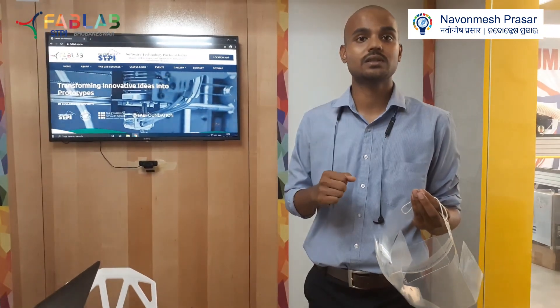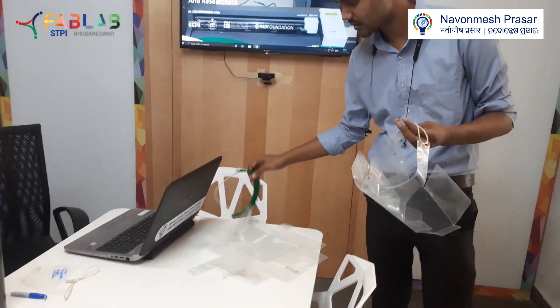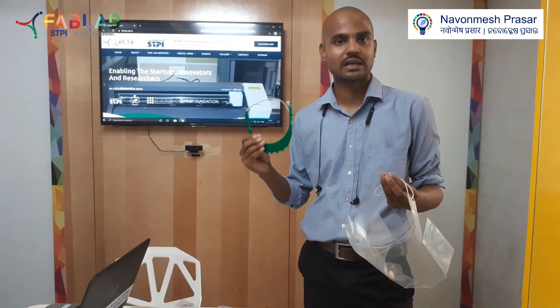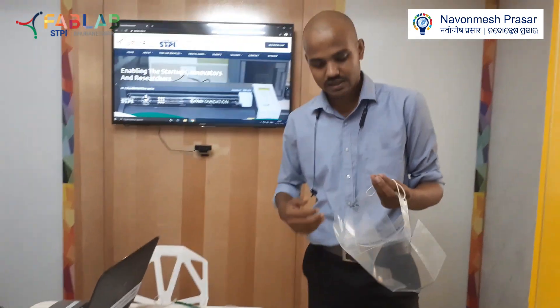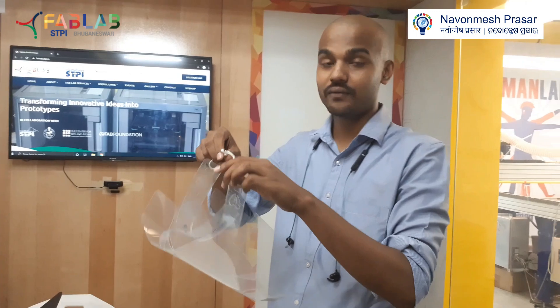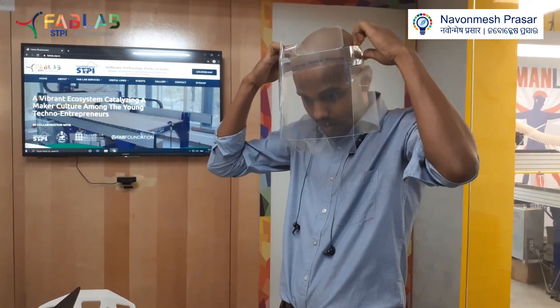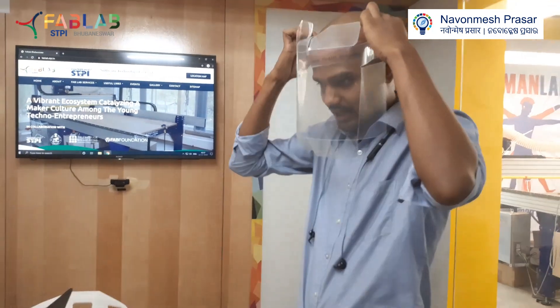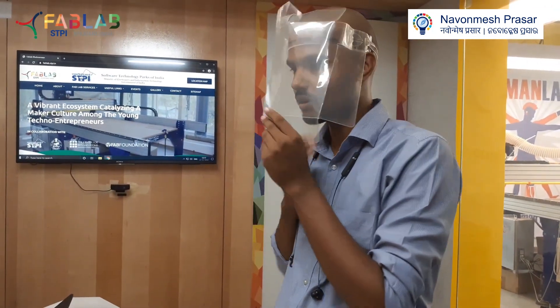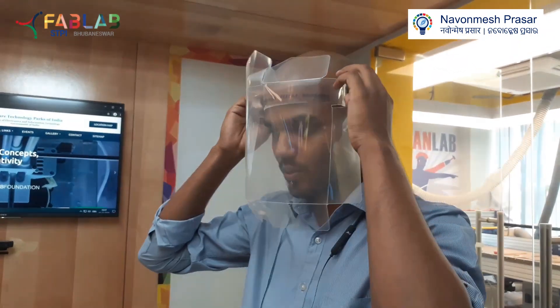It also reduces the weight — since other designs include these kinds of frames, the weight of the shields significantly goes up, but here you won't feel anything when you wear this. There is also a lot of space for ventilation between your face and the shield, so doctors can easily wear this and they will feel like they are not wearing anything.